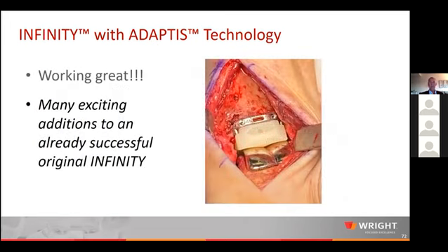So again, something I've learned from this case, and I might recommend to you that if you see the report come back and say you've lost height, we're going to plan on under-resecting bone, you might want to bail out immediately or plan ahead of time to do the flat cut talus rather than try the chamfer cut itself.